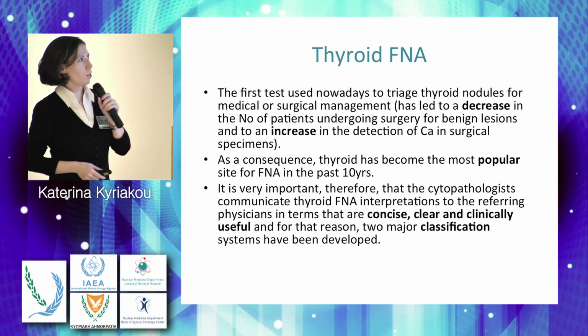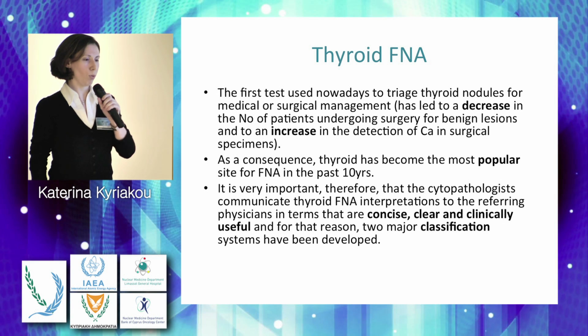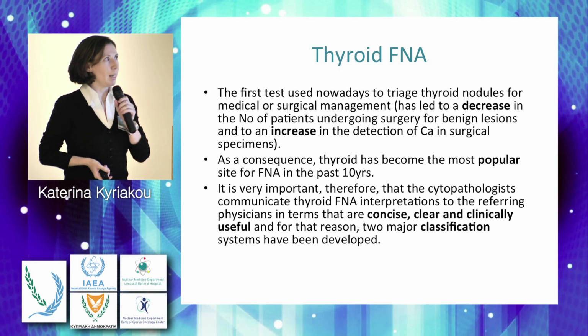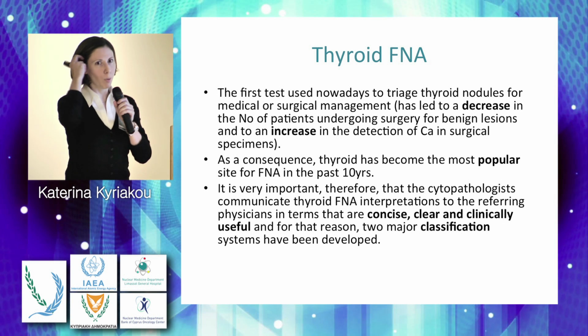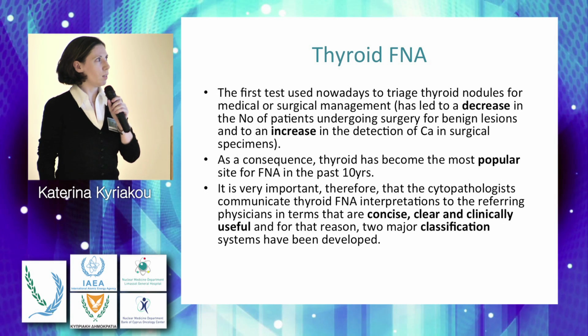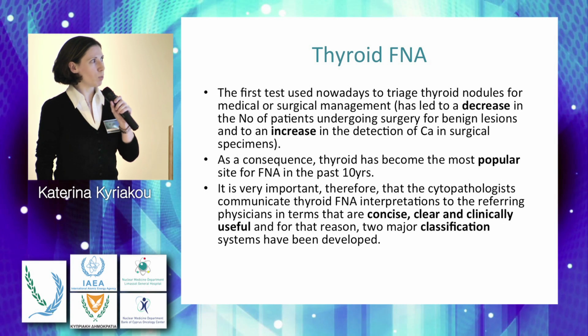Thyroid FNA is the first test nowadays to triage thyroid nodules for medical or surgical management. And it has led to a decrease in the number of patients undergoing surgery for benign lesions and to an increase in the detection of carcinoma in surgical specimens. As a consequence, thyroid has become the most popular site for FNA in the past 10 years.